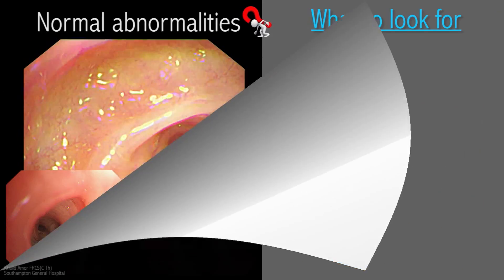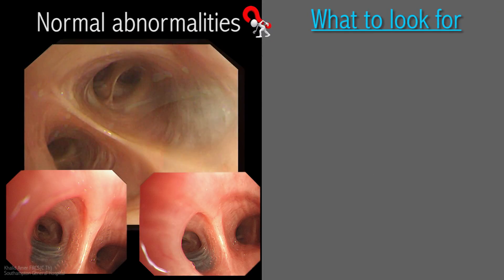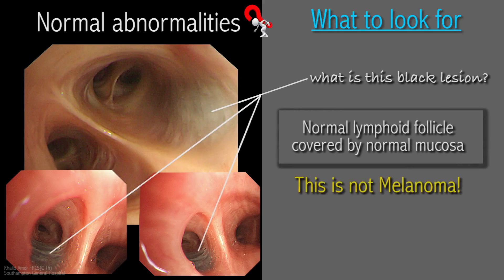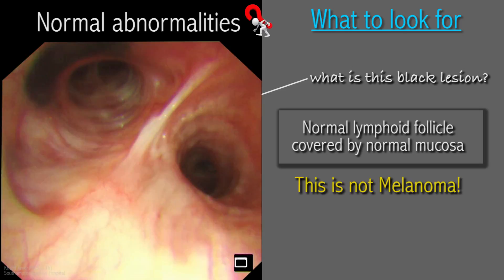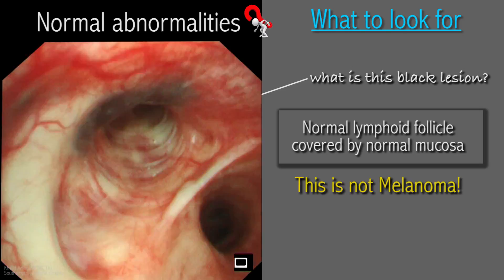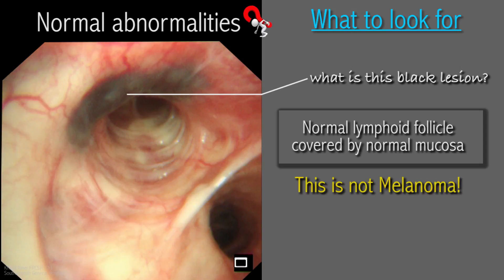Also common is the finding of submucosal black discoloration, which represents normal lymphoid tissue and can be confused with melanoma. The covering mucosa has a normal sheen to it, and this differentiates it from a cancerous process.